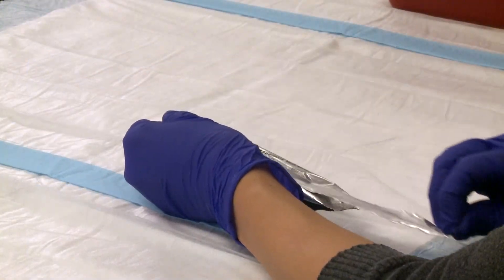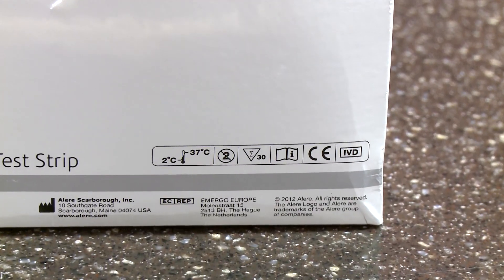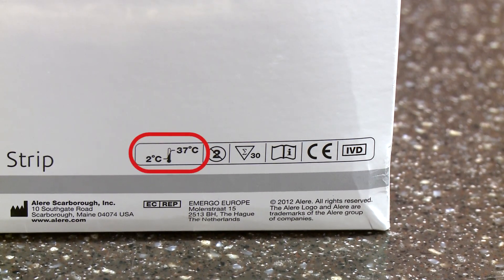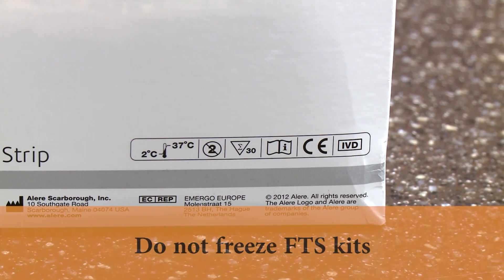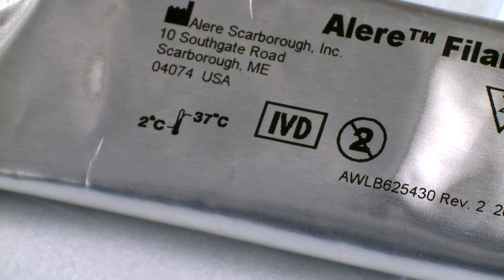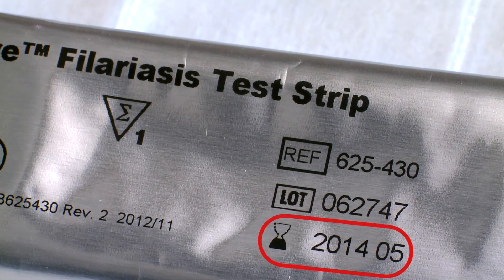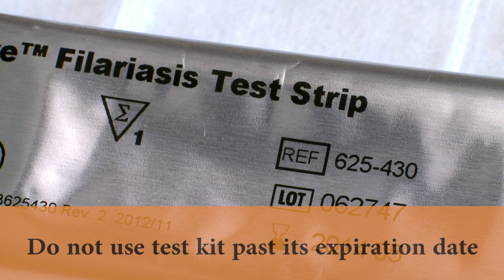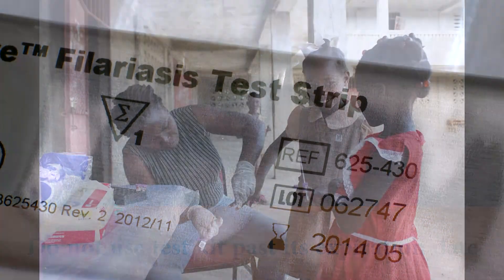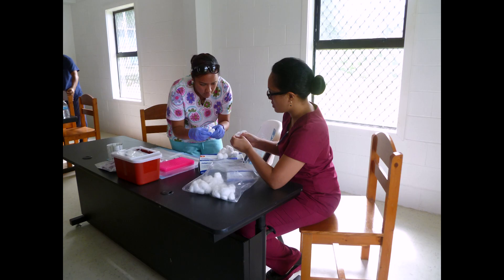There are some basic guidelines to consider when using the FTS. FTS kits should be stored at 2 to 37 degrees Celsius, ideally at 4 degrees Celsius. FTS kits should never be frozen. The FTS kit is stable until the expiration date marked on the outer packaging when stored as specified. Test kits that are past their expiration date should not be used. During testing, care should be taken not to expose strips to extreme heat or direct sunlight for prolonged periods of time.